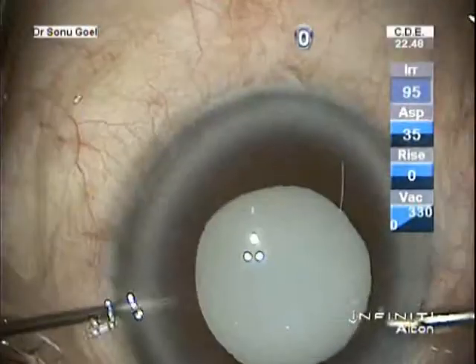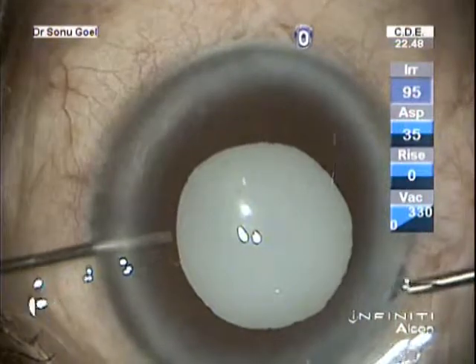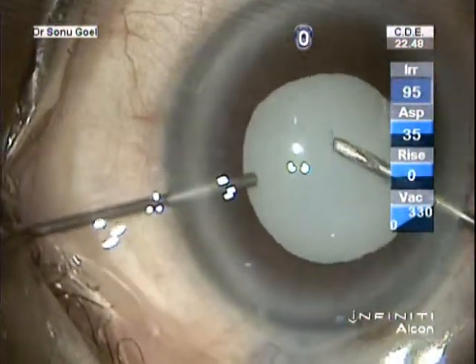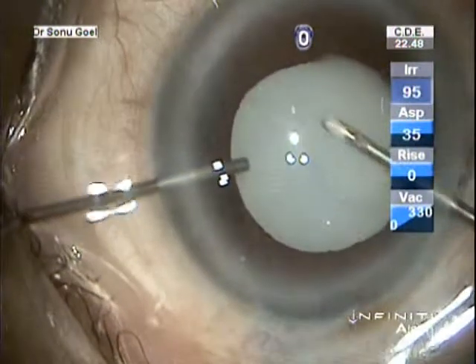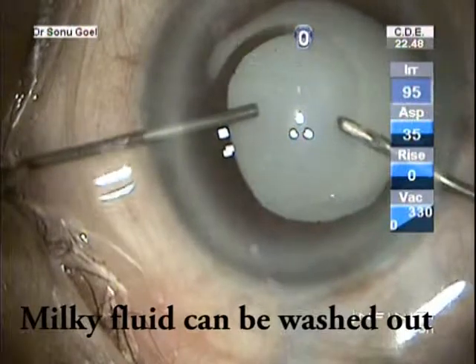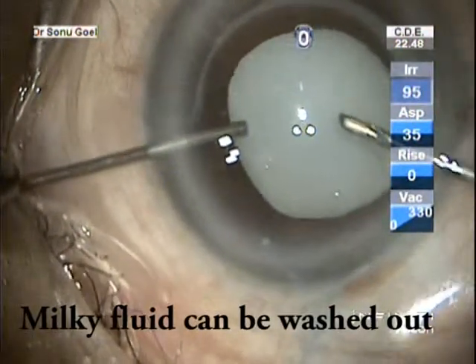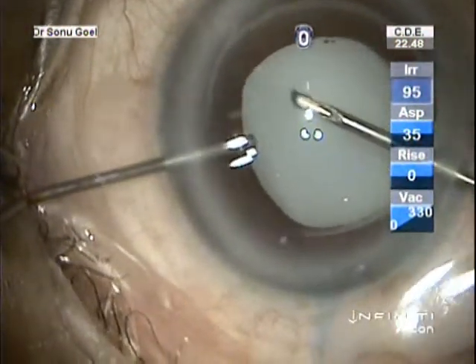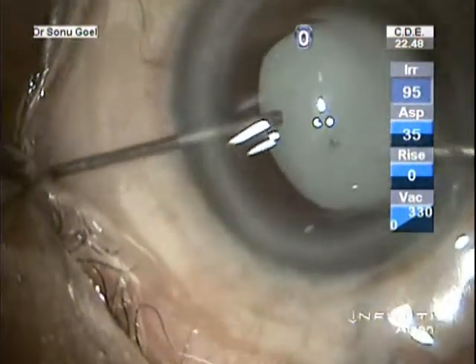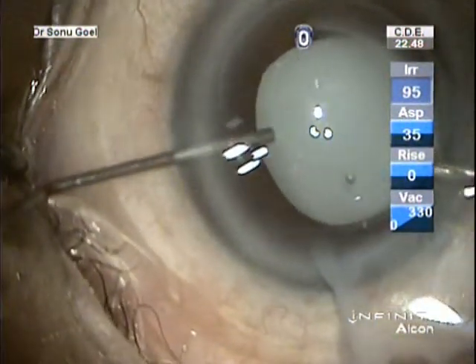Another case you can see here, it's a bag filled with white milky fluid. So side port with viscoelastic. The moment the nick is made, the white fluid, the milk, comes out. See here, the viscoelastic is used to wash away the milky fluid so that easy access is made to the visibility. A positive tamponade is being created and the flap can then be moved easily.